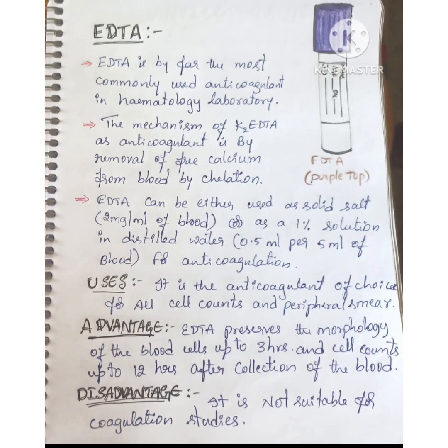EDTA is by far the most commonly used anticoagulant in hematology laboratory. The mechanism of K2-EDTA as anticoagulant is by removal of free calcium from blood by chelation. EDTA can be either used as solid salt for 2 mg per 1 ml of blood or as a 1% solution in distilled water for anticoagulation. It is the anticoagulant of choice for all cell counts and peripheral smear.